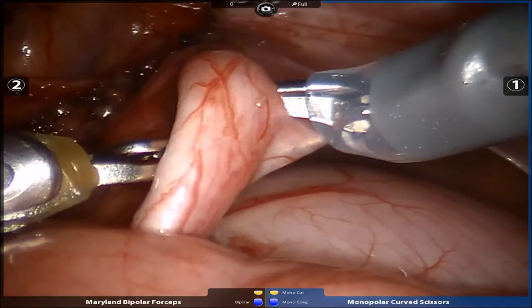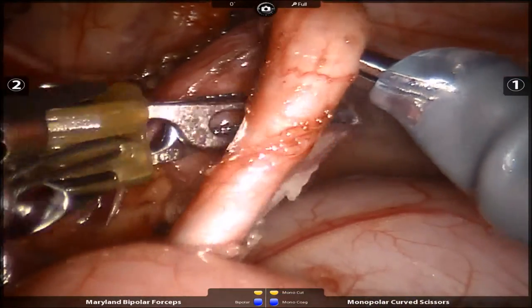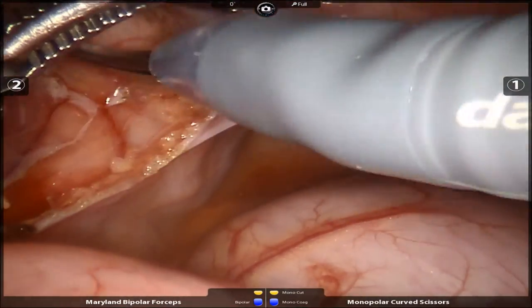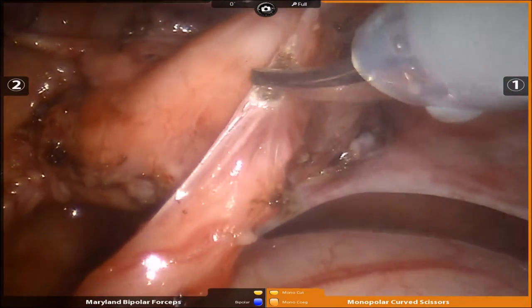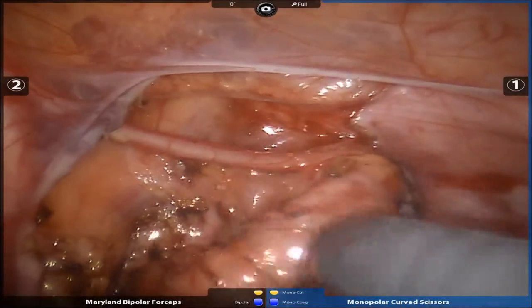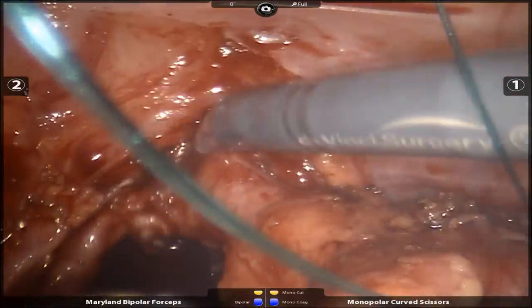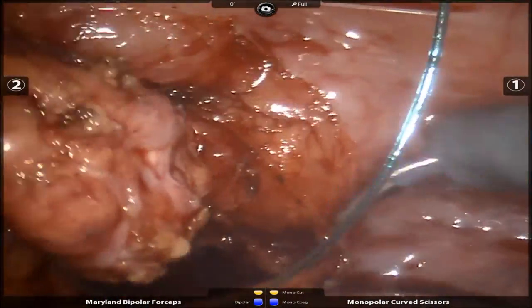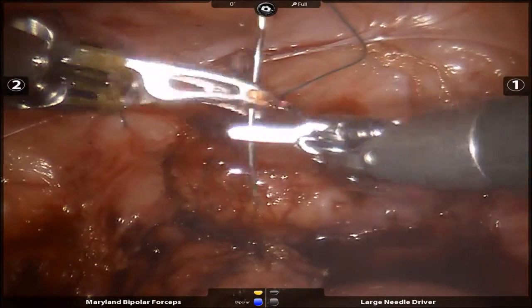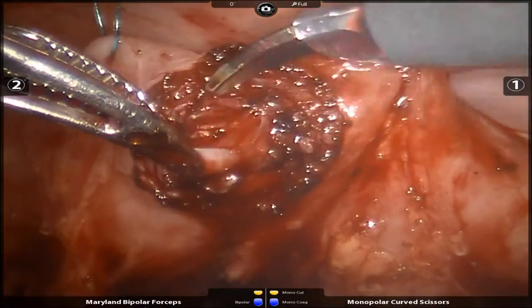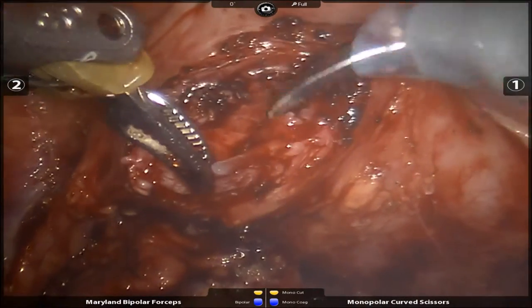Robotic dissection begins with identification of the ureter and mobilization. The cephalad extension of the diverticulum can easily be identified abutting the ureter, and the ureter is mobilized from the edge of the diverticulum. Traction sutures are placed to aid in dissection of the ureteral tunnel for re-implantation. The detrusor is incised, leaving the mucosa in place in the standard fashion for an extravesical ureteral re-implant.